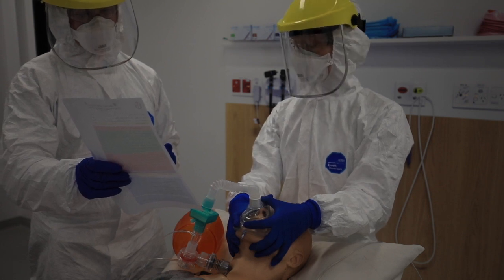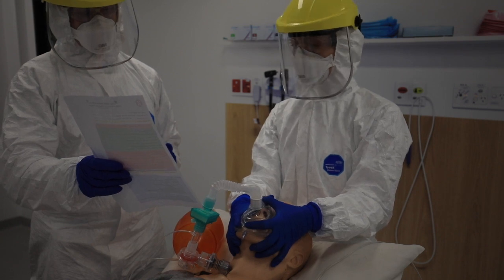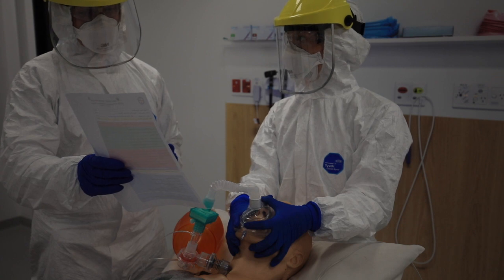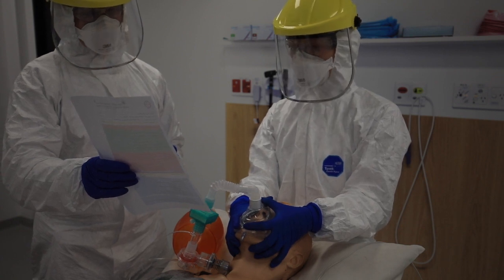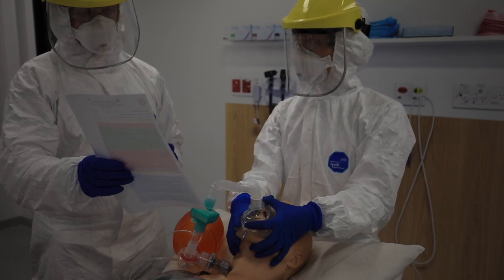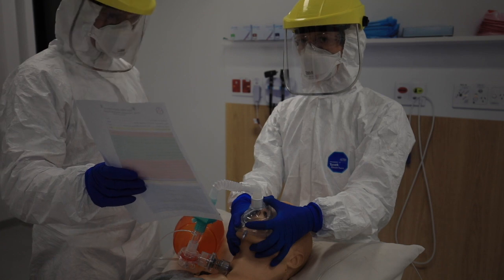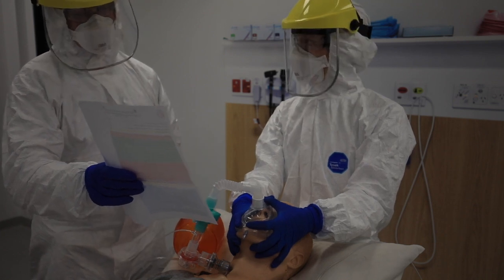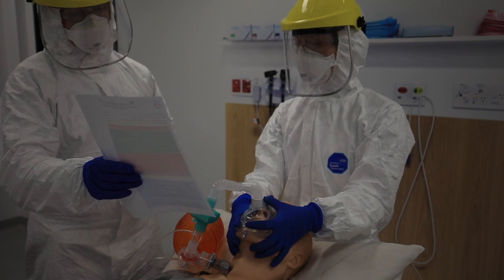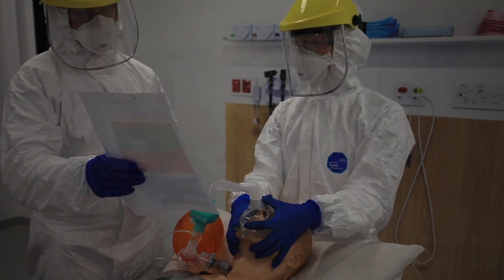Connect the circuit back making sure the HME filter is there, then ventilate — keeping an eye out for any cuff leak. C-Mac comes out with secretion control, going to the dirty area. If we run into any trouble, re-oxygenate using the i-gel — nothing else before that. Gentle bag reminder.